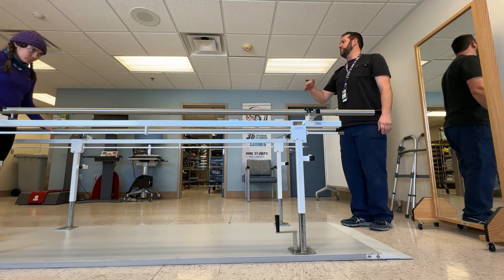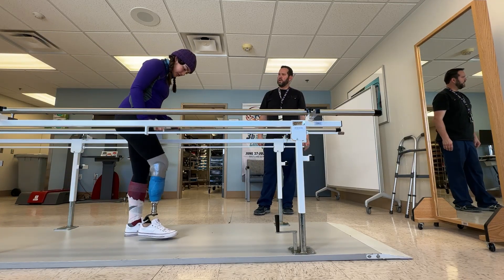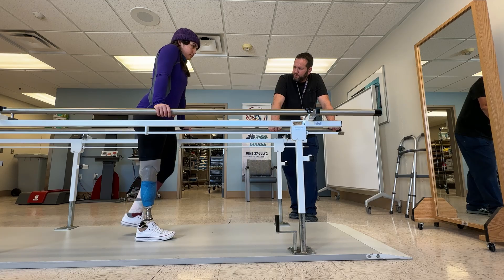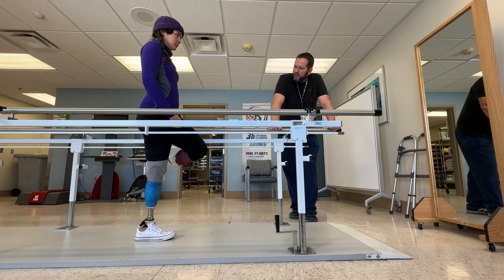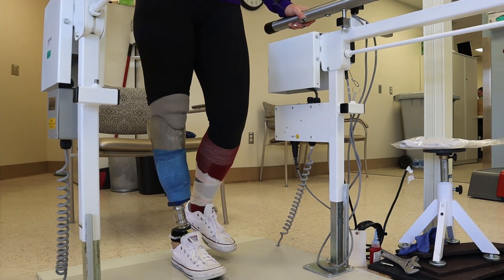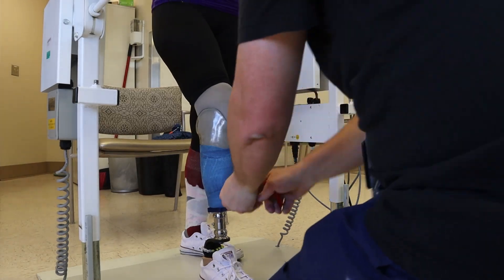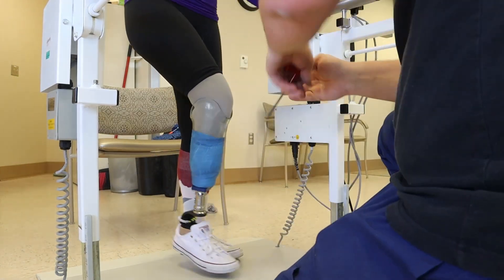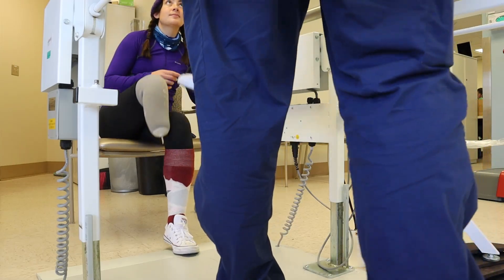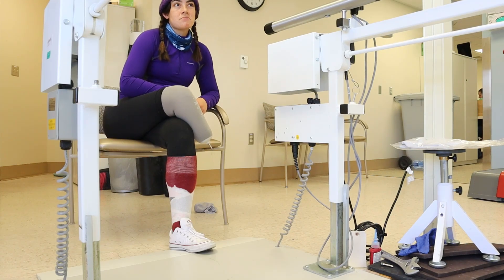Does it feel wobbly? The other one felt like you were bouncing around inside the socket. Does this one feel like you're bouncing around at all? I feel like I'm staying down a lot more, but there's something over here that's just bothering me. I couldn't tell you where it is. Let's take a look inside the socket and see if there's anything obviously jumping out at us. I'm way on the outside of my label. That's really bad. I'm trying to take as much of that out so that it's not hitting on the side. We're chopping a line down the middle to try to get your alignment, and we're trying a different piece — a wedge instead of an outset — to see if we can keep you from hitting the other leg. Clearly that is not going to work, so let me try it again.